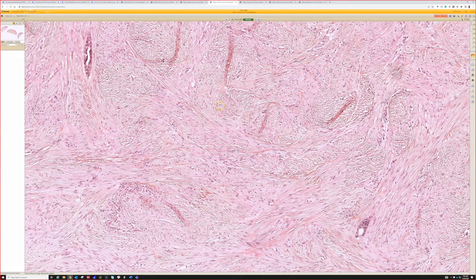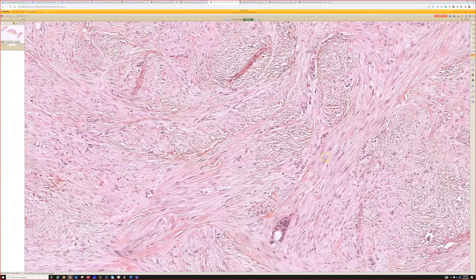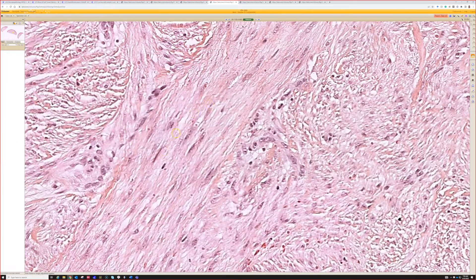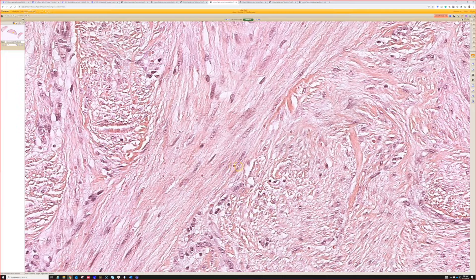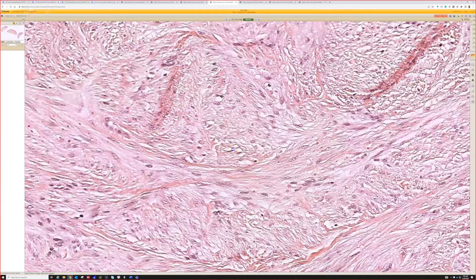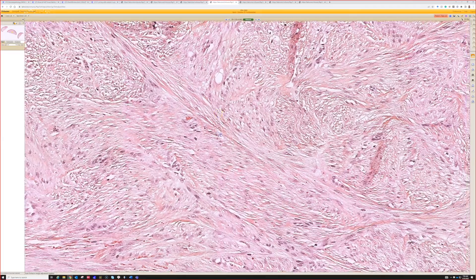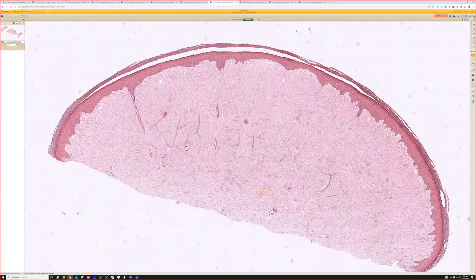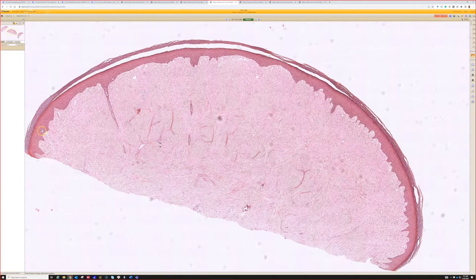There are elongated nuclei in the fascicles, and if you look closely, there are these little pink balls — inclusion bodies — in there, which are helpful for identifying what this is. It would be an inclusion body fibroma. This is a dome-shaped papule — if ever there was a dome-shaped lesion, this is it — with acral skin epidermis and the dermis replaced by a bland spindle cell proliferation arranged in fascicles.